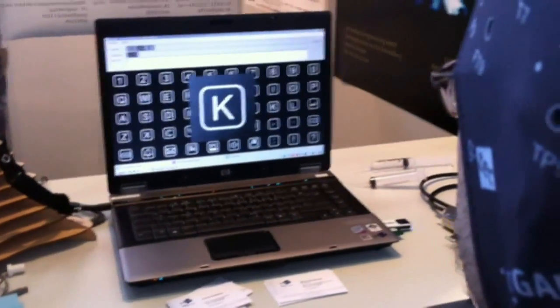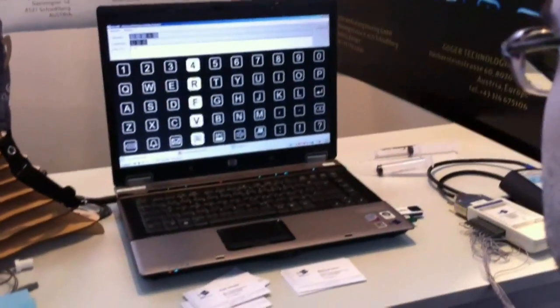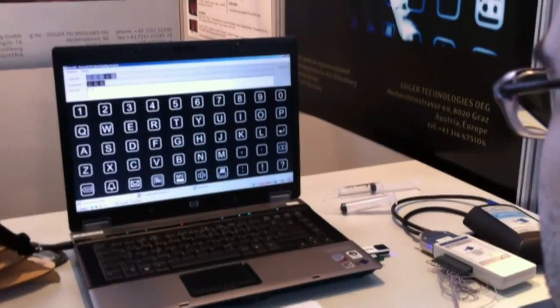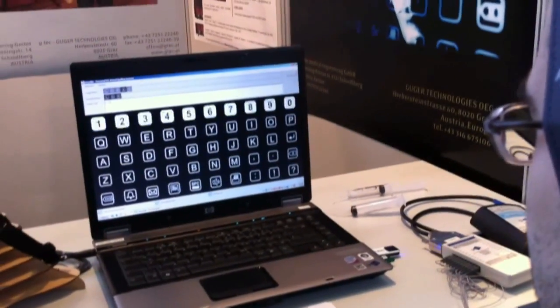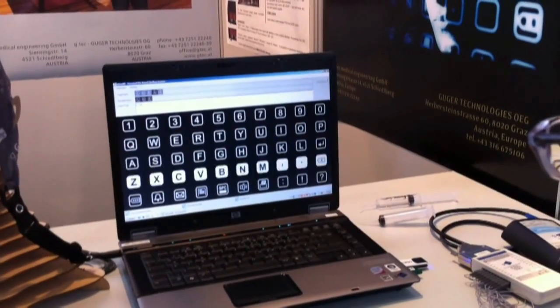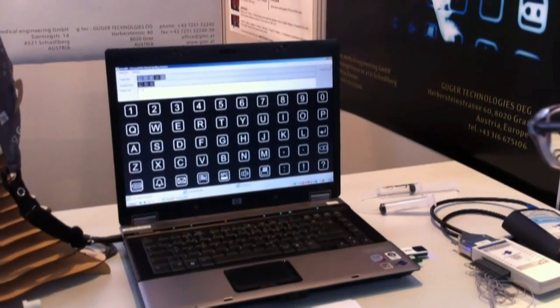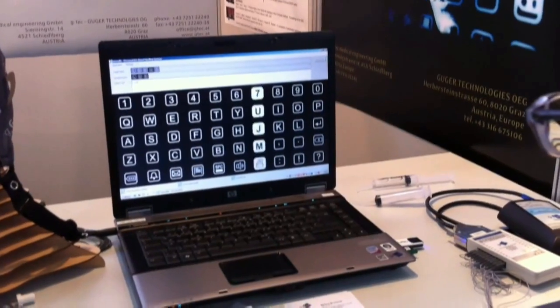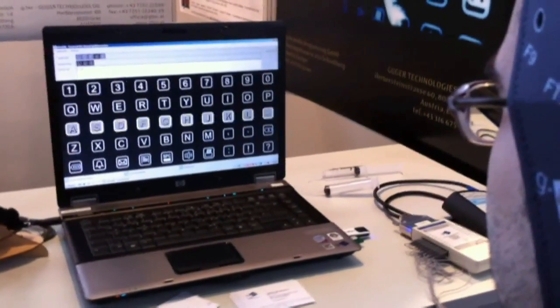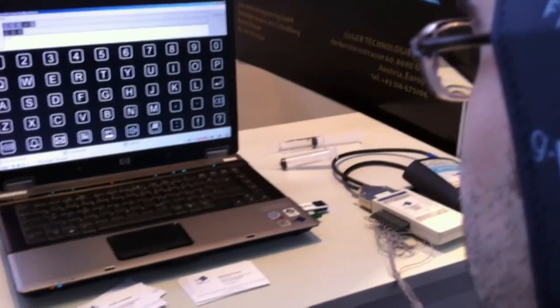Now I got the message from his brain to put the K there. No keystrokes — just with his head. So then as a person works with this longer and longer, it becomes quicker and quicker, because it gets to read your brain — it learns.